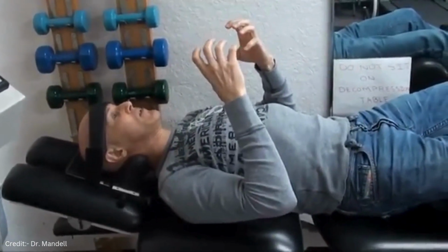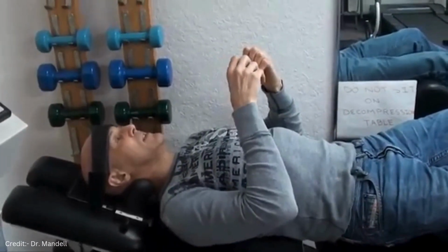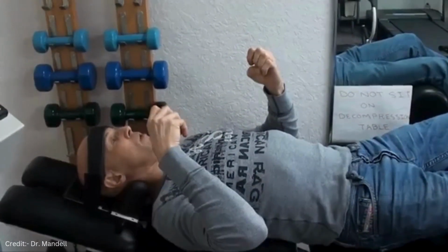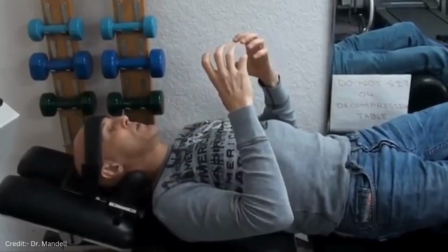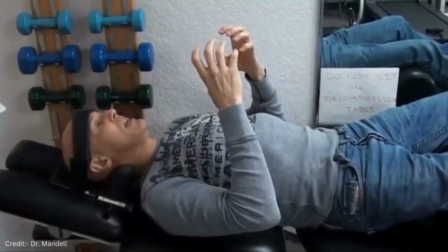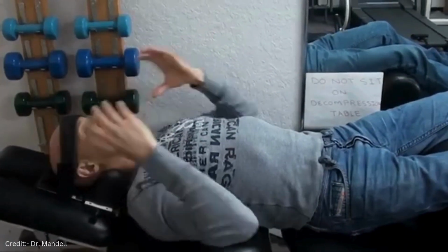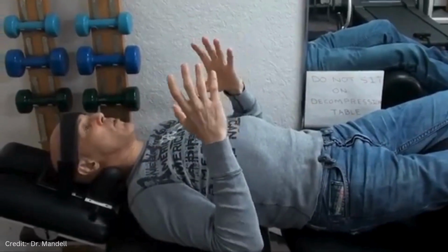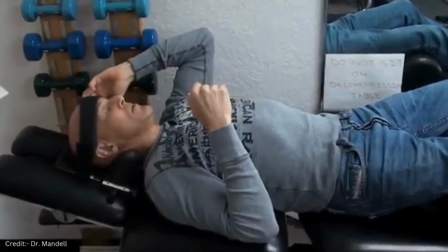So as it comes back down, it's going to keep that 25% contraction so the muscles don't go into spasm. When they totally relax, the muscles can spasm, and then it's going to continue to pull out, and it's going to hold it again for 45 seconds, come back down, hold it for that 25% contracture, and then eventually, when the time limit is done, however long we set the time for, 7 minutes, 10 minutes, 12 minutes, that would be the total session.